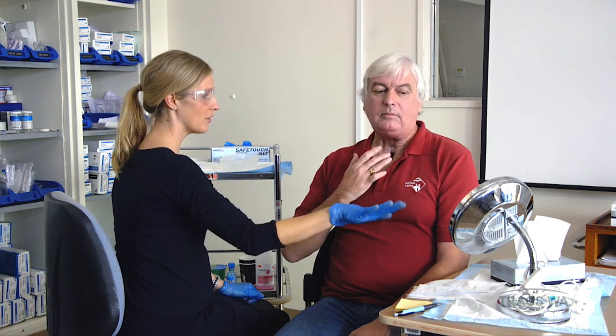You put more pressure on there, which I would normally do. It's hard to know how much pressure to put, and we have to get it just right, because if you're pushing too hard with your finger or your thumb, you can actually block the front of the voice prosthesis, so you're not getting any airflow going through it. So we'll get you to count from 1 to 5 again, and just really focus on getting a good seal with your stoma. You can use the mirror to look in there if you like.